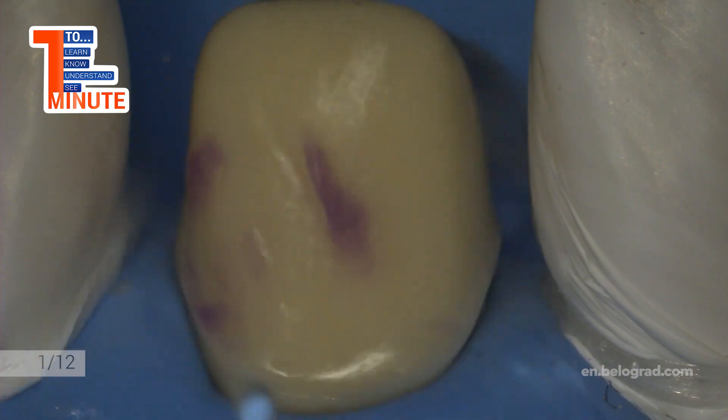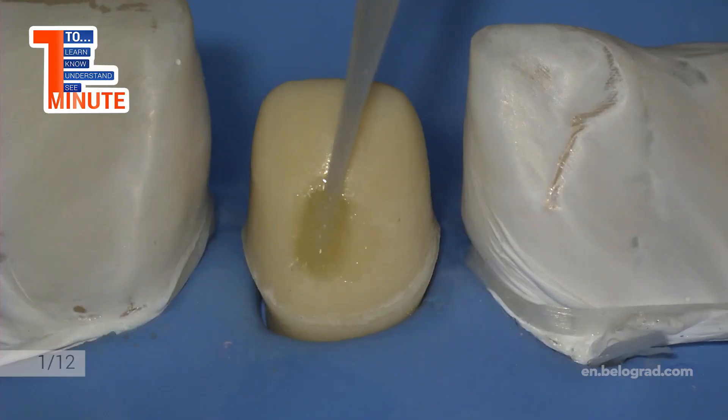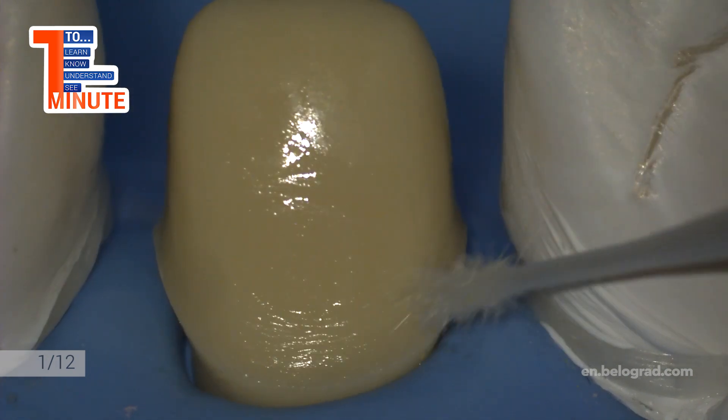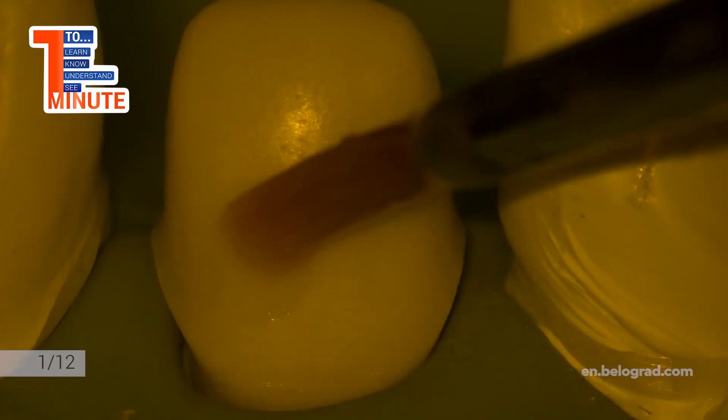The sequence of procedure is following. Dentin is etched with phosphoric acid no more than 10 seconds. Etching gel is rinsed out, tooth is dried, and dentin should be slightly moistened.